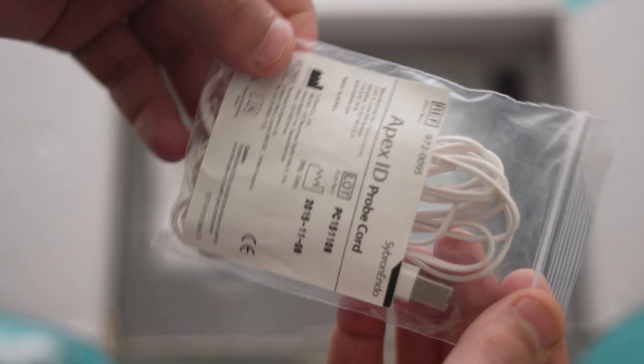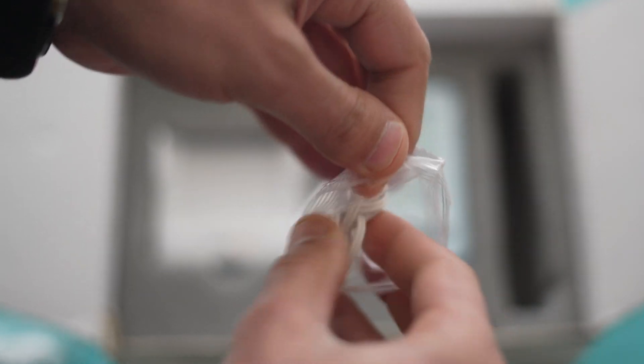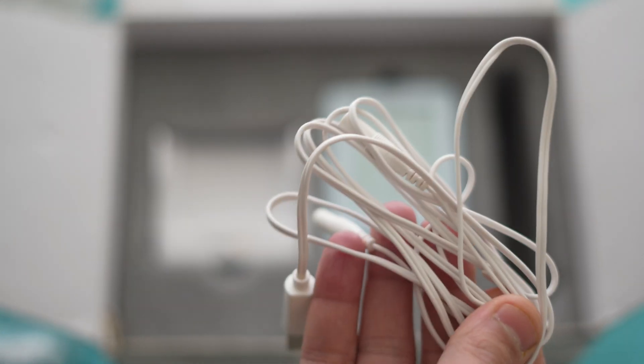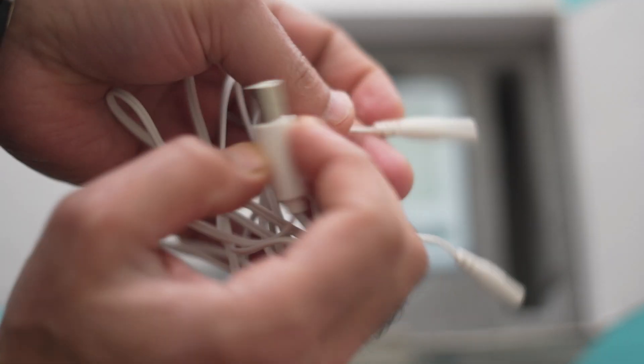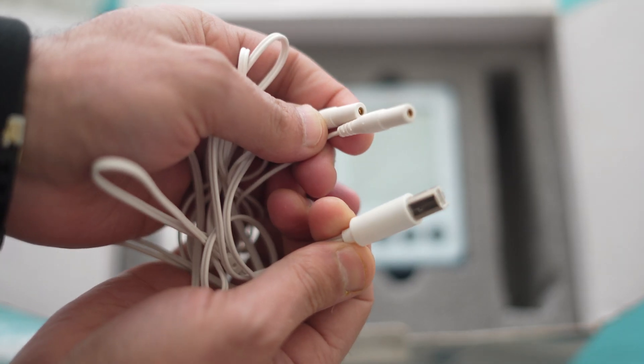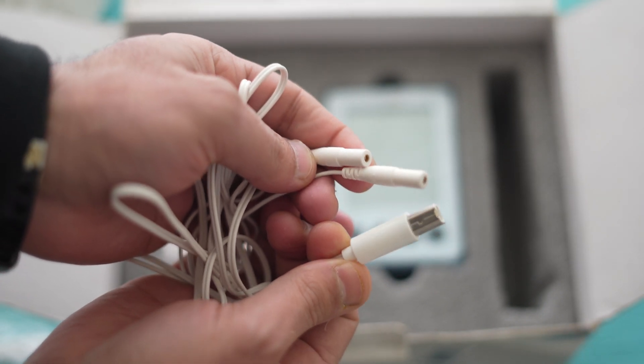The next accessory is this Apex ID probe cord. This is a cord which connects to the Apex locator on one side via the Apex locator jack, and on the other side it can be connected to the lip hook and the file holders. So this is the probe cord.